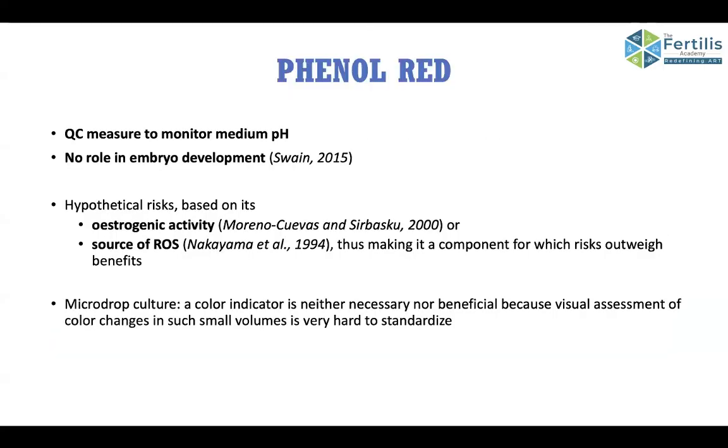Phenol red was present in most of the medias in good old days when we started working 15, 16 years ago. But now it is not a very favored molecule. Phenol red will become pink when the media was equilibrated, but it was a qualitative test. You could never measure the pH correctly with the help of a qualitative test, especially when you are working in small drops.